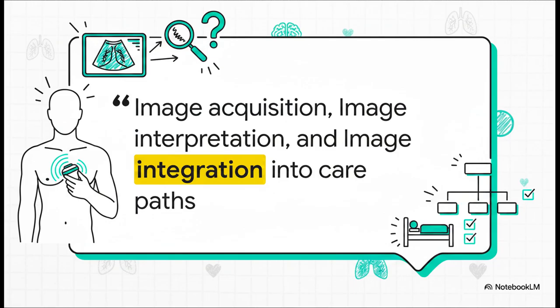To quote Dr. Greg Hall from The Skeptic's Guide to Emergency Medicine, bedside ultrasound has 3 distinct skill requirements: image acquisition, image interpretation, and image integration into care paths. I love this quote so much because it drives home the point that ultrasound is an active, dynamic clinical tool. It's not just some imaging request you fire off to a technician. You are the diagnostician, working in real time.